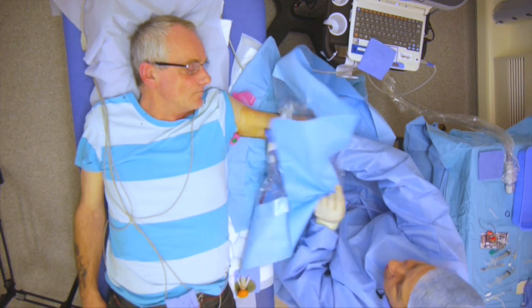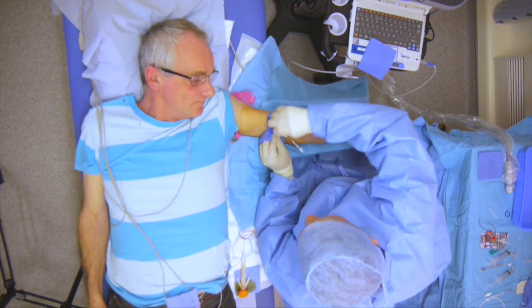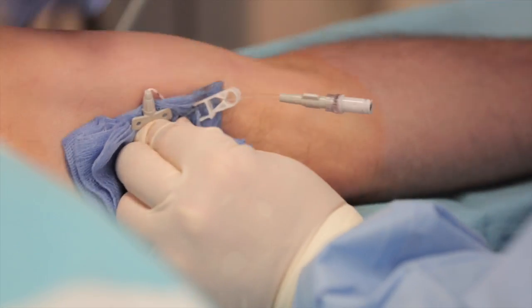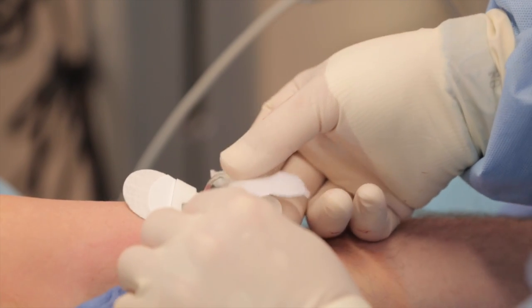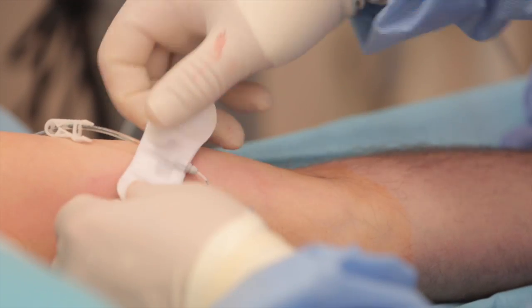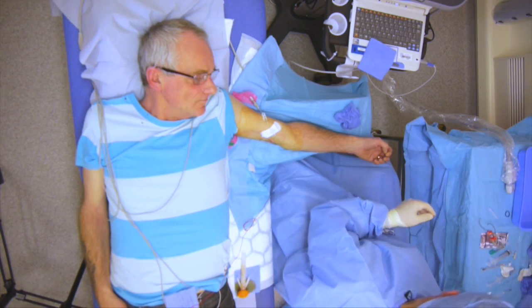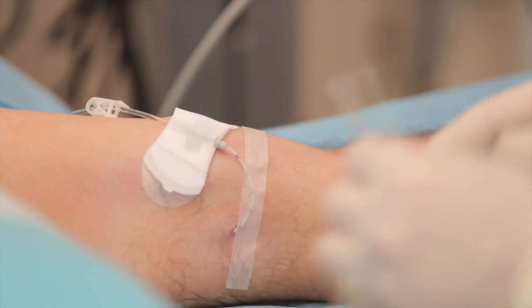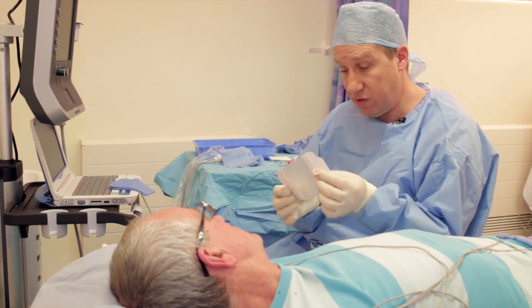Final steps: pressing on the insertion site to keep it firm. A securement fixation device is applied with a firm grip and positioned on the arm. A steristrip is placed over the insertion site for the first day or so, with a small piece of gauze underneath. This initial dressing will be changed in 24 to 48 hours for a standard clear occlusive dressing.